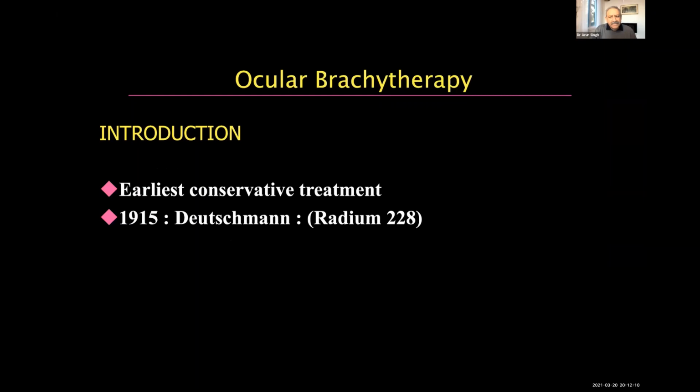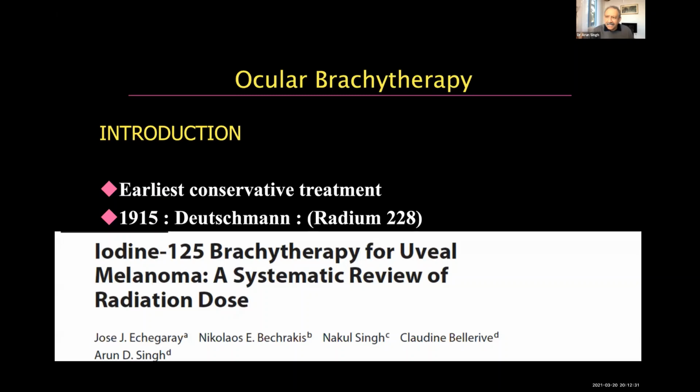So patients always ask me, and I want to share this with you, that ocular brachytherapy is nothing new. It's been there for more than 100 years. This is the oldest reference that I can find. I don't have much literature on this particular article. It's in German, but they do refer to the use of radium-228. But in common ophthalmic textbooks, we have a slightly different history. And this is a source article where you can go and read all about dosing and efficacy and recurrences, etc. A whole systematic review for uveal melanoma brachytherapy. And we talk about history here.